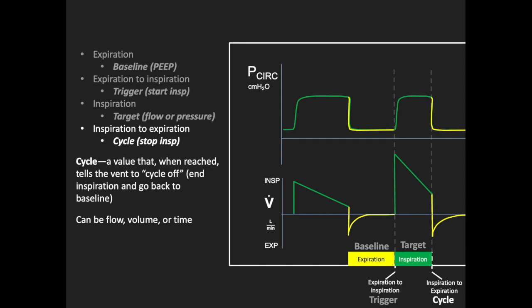Pressure support ventilation is special compared with the volume assist control and pressure assist control in that the patient has control over how long the breath lasts or how long inspiration lasts. And that's because pressure support ventilation is a flow cycled mode. And this is a little complicated. It's harder to understand than volume cycling and time cycling, but it works like this.